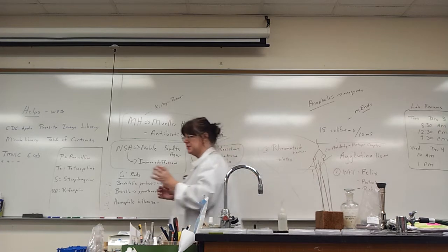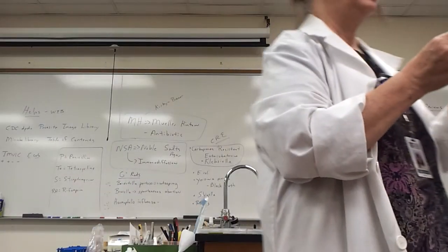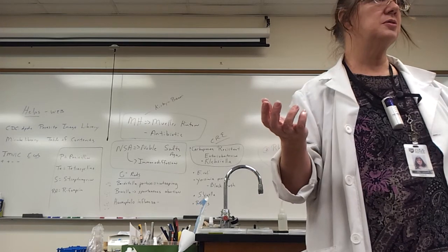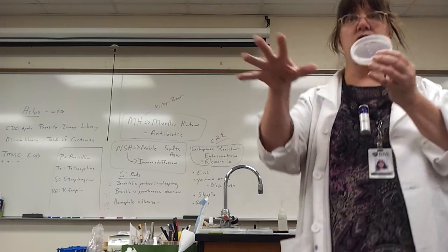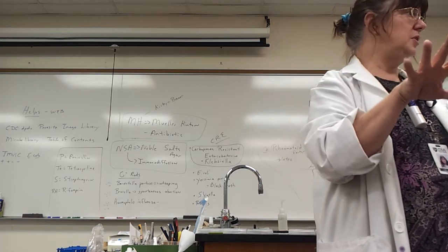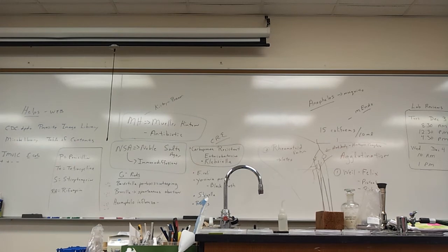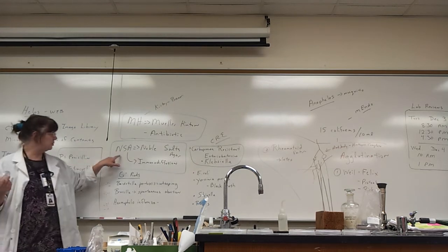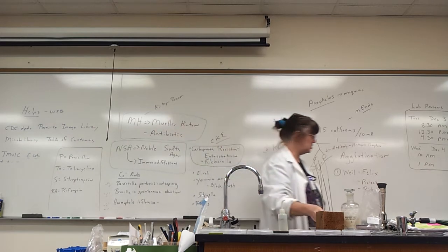Now we're moving to a different test. I'm not going to make you learn the technical name. I'm going to let you call it an immunodiffusion plate. Immunodiffusion, because what happens? The antigen or antibody that you put in the well diffuses out. Now, the questions for this can be several. First is given the type of the plate. This plate is a noble agar plate for immunodiffusion.